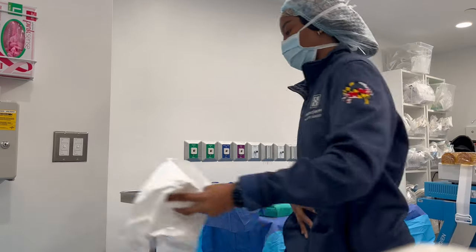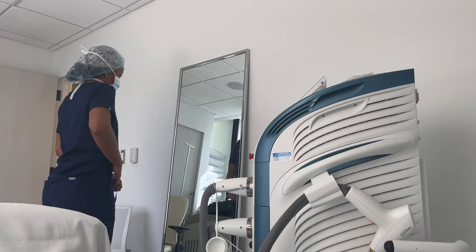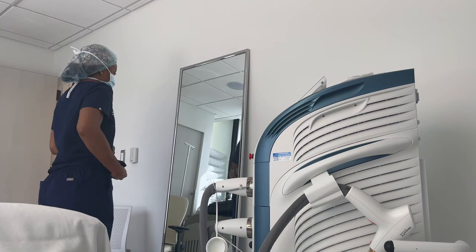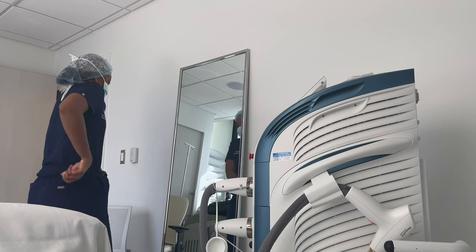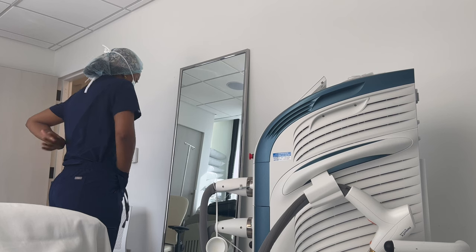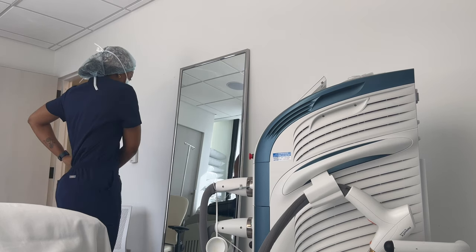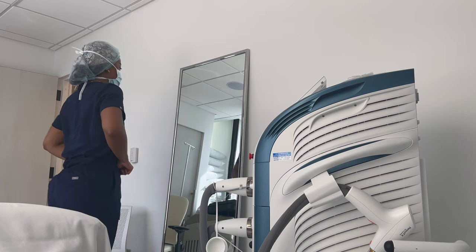Then I'm opening a pack of Betadine to put on the field, because we usually wash the implants and the incision with Betadine before putting in implants. And then here I am just getting ready. I like to tuck my scrubs and get everything tucked away before I scrub into the case.